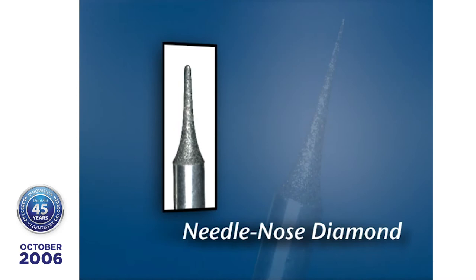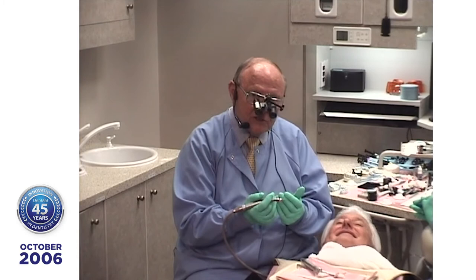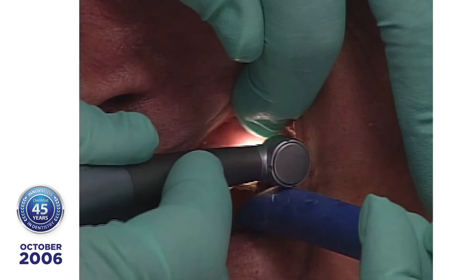Okay, now we're going to take the needle nose diamond and think about this. We never did any preparation on the teeth, right? No. Okay. So we created a shoulder. Now you create a shoulder when you prep the teeth. Now we've created a 0.5 millimeter margin, right? Only it's extra. What we're going to do is take that 0.5 millimeter margin away after we got it bonded with ultrabond. So now I go back around after I've done the 12-fluted burr and I go into these embrasures again.